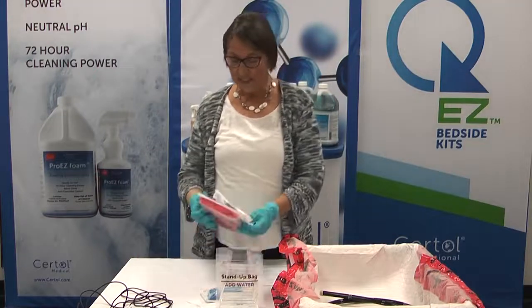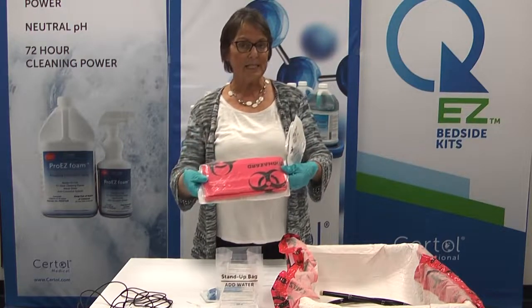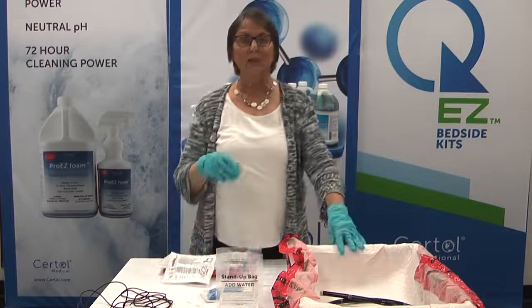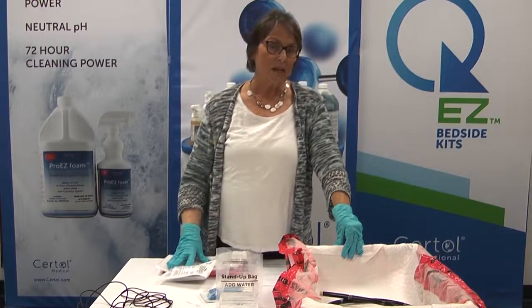The QEZ bedside kits do come in different components. We have sets that have different pieces in them and we're going to go over what some of the components are, and today primarily give you a little information on how the kit is actually used and the value and benefit of using this type of kit.